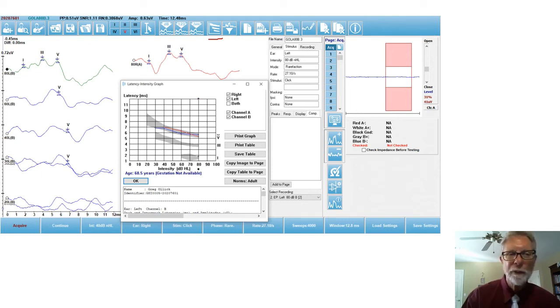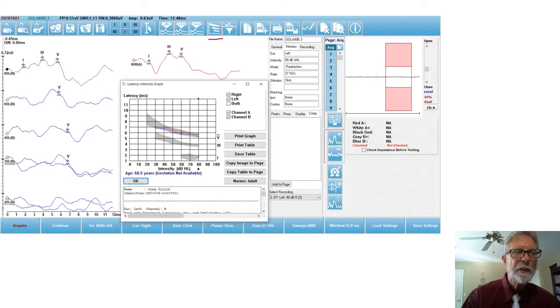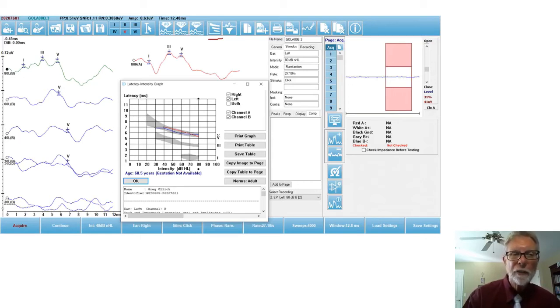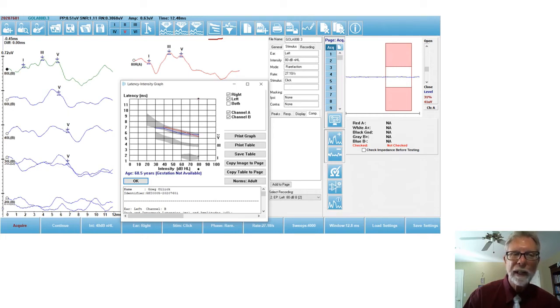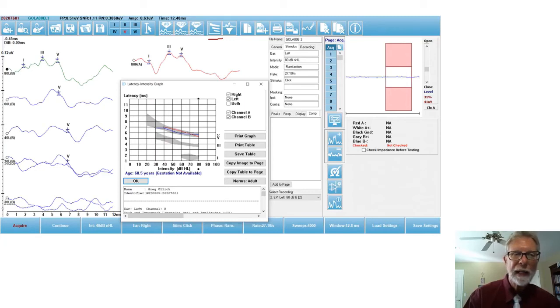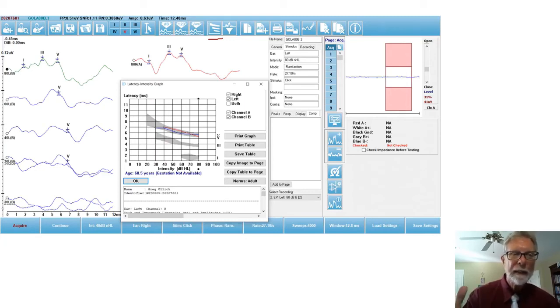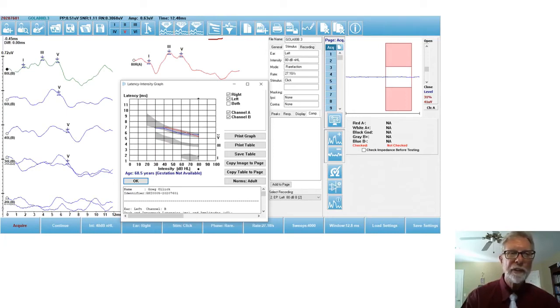And I can have it available so that as I'm marking the waves, my cursor will move on the graph and I can see where I'm falling on my latency intensity graph for waves one, three, and five. It helps you mark. And of course, I have that available when I've done a latency intensity series.